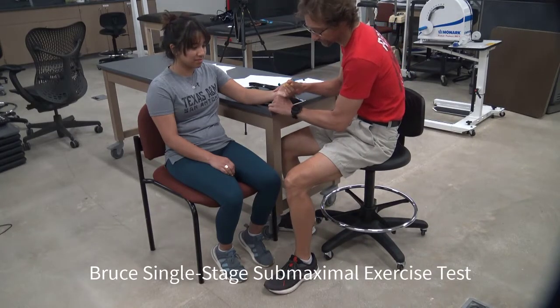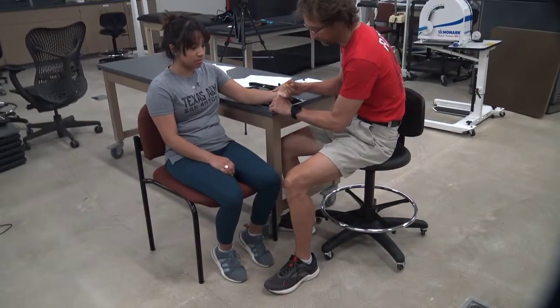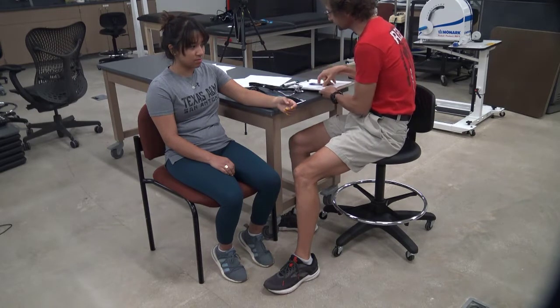This is a demonstration of the Bruce single-stage submaximal aerobic capacity test. This test allows us to calculate an estimated VO2 max, which can serve as a means to help more accurately prescribe exercise for our clients.